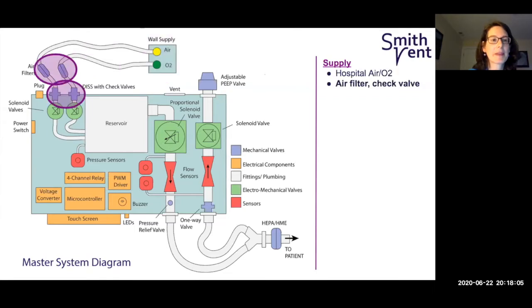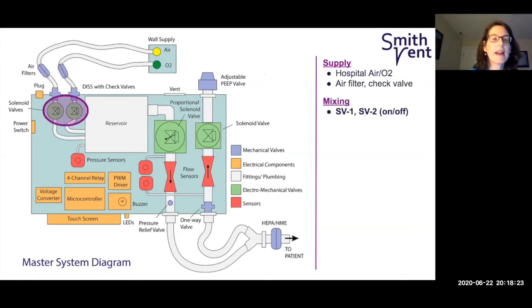per square inch. The air and the oxygen lines both have inline air filters, and there's a set of one-way check valves to prevent reverse flow. The back wall of the ventilator has DISS fittings that ensure the two lines can only attach to their intended ports and not accidentally be reversed. After entering the ventilator, the air and the oxygen then go through the first set of solenoid valves, which we call SV1 and SV2. These act as on-off switches to control how much of either gas can pass through.